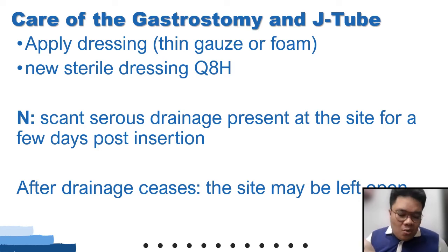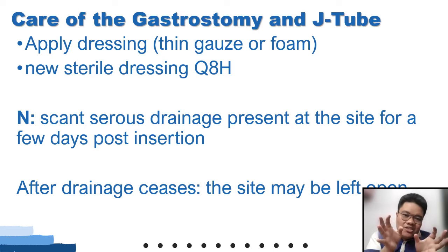If you would actually look at the gastrostomy tube class, there is some cover there that is being used. No? Okay, it's like a cover that covers the access, and then that is where you are inserting the tube that you use for feeding. So once class, there is no drainage already, that usually happens at around 7 to 10 days post-operatively. Okay, 7 to 10 days post-operatively. So what could possibly happen, class? You can remove already the dressing of your patient.